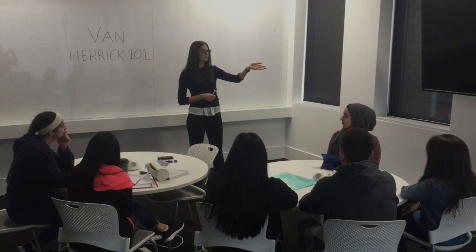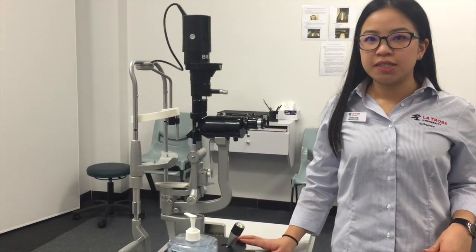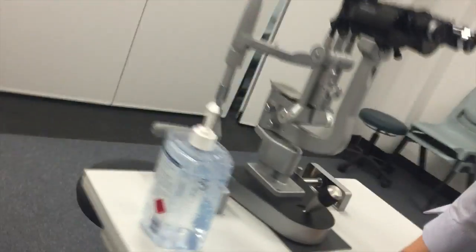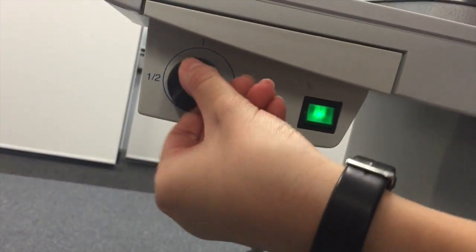That was an introduction to the Van Herrick technique and now we'll watch a quick video of our clinician performing the skill. Before the patient comes in, we will set up the slit lamp for the Van Herrick test. We'll turn on the machine and have it on the highest illumination, which is two.